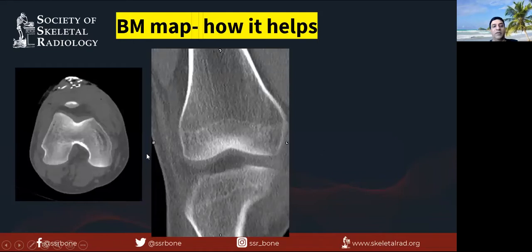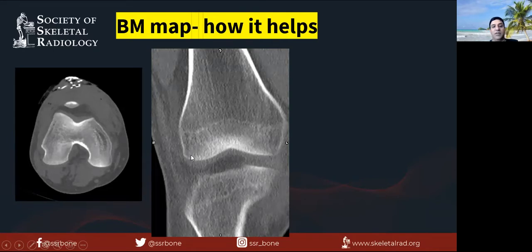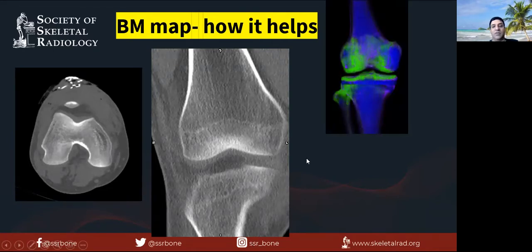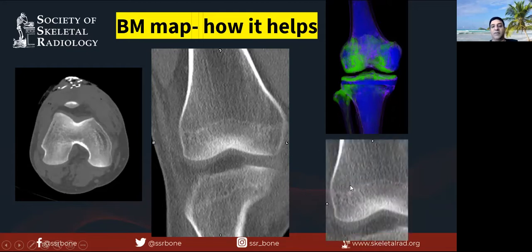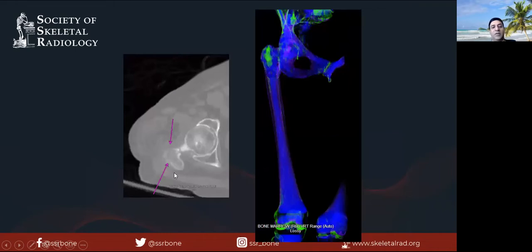Fractures can be subtle. Here we have sutures from a previous injury and nothing shows up much on conventional CT. But on the bone marrow map, there is edema of the lateral condyle of the femur as well as across the proximal tibiofibular joint. Looking carefully, there is trabecular distortion of the femur where a tiny air pocket is also visible. This was actually a missed non-displaced peritrochanteric fracture, but that's where the edema is.